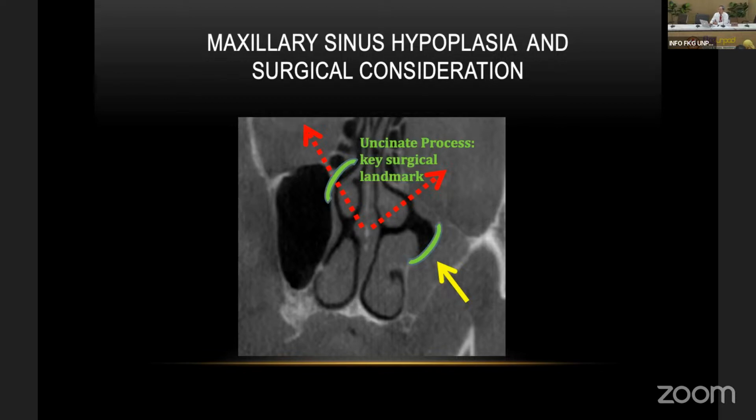So this is the floor of the orbit. We need to recognize this anatomy.